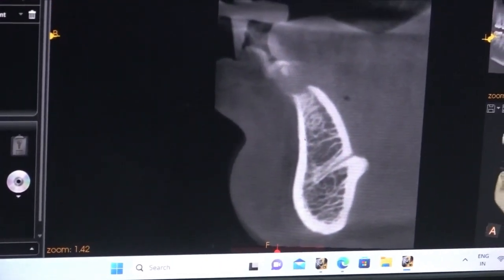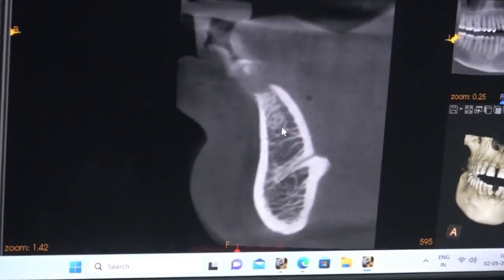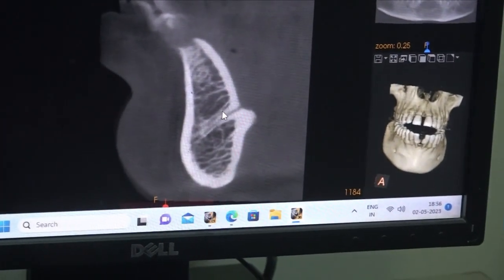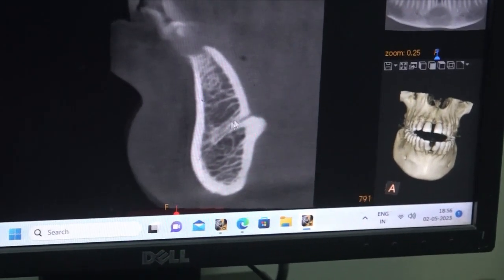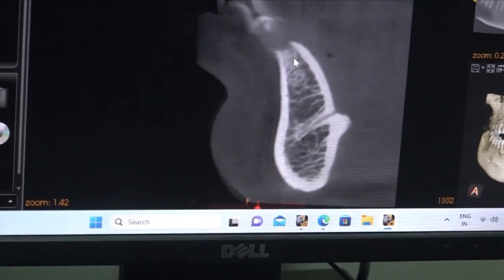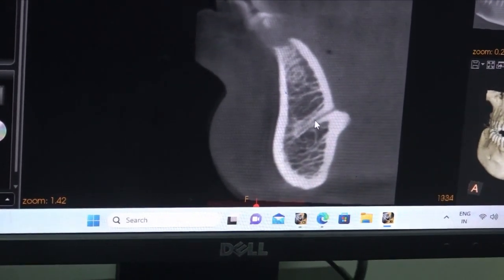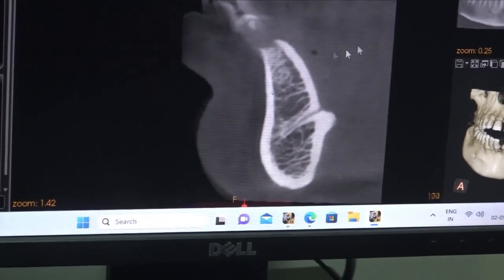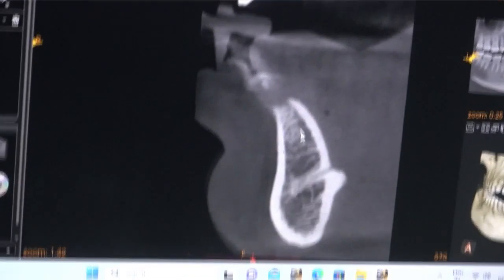Okay. So if you place BCS, when the BCS is entering here, it will be very strong. The moment it goes beyond this spot, it will not be. And in the midline there is a lingual vessel coming, which is dangerous. So you should not drill beyond this vessel. That is why if you are placing an implant in the midline, you should be very careful. If this gets disturbed, you will get severe bleeding on the lingual side. Life threatening problems can happen.